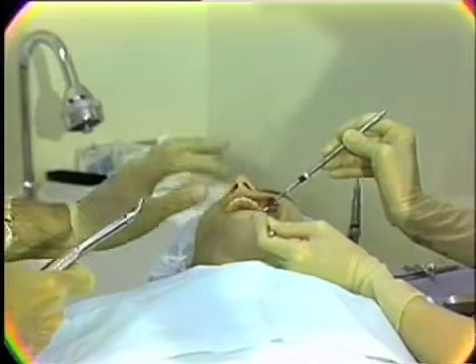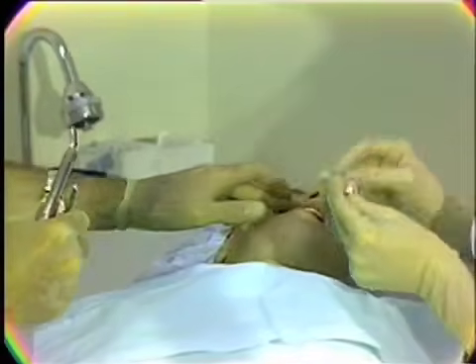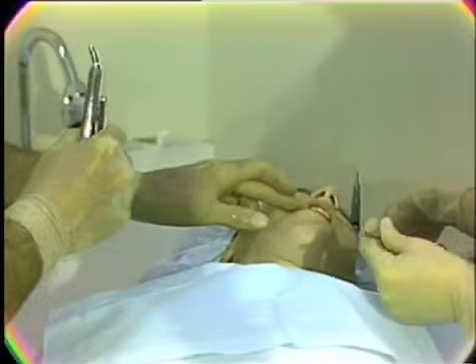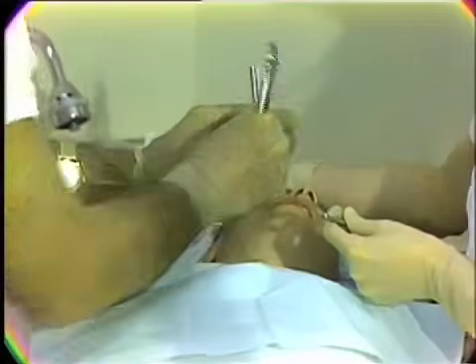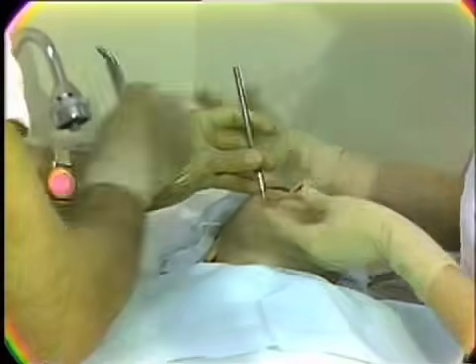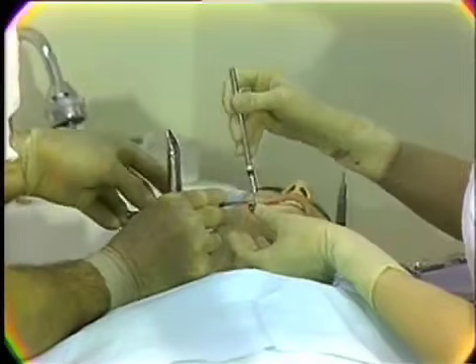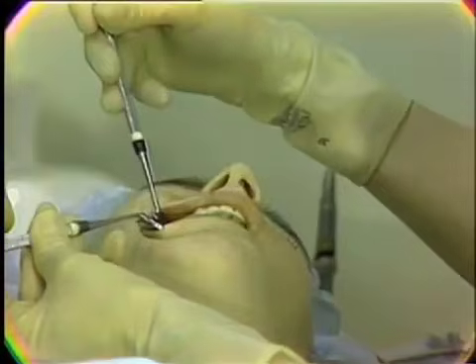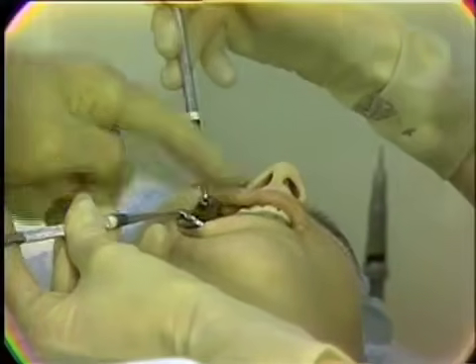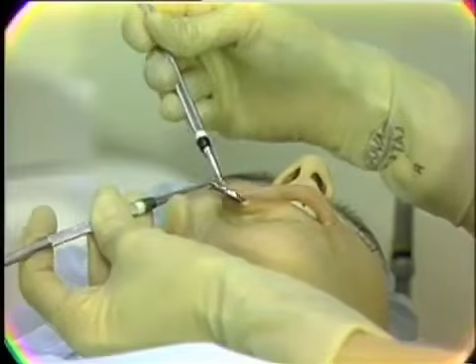The approach to the opposite side is achieved in the same manner, asking the patient again to turn away from you. You maintain your direct vision and position. The approach is made with the retraction of the cheek with the mouth partially closed again, and we have an approach that is again feasible to the maxilla on the right side. So it is these positions that will allow us to gain access to the maxillary arch.